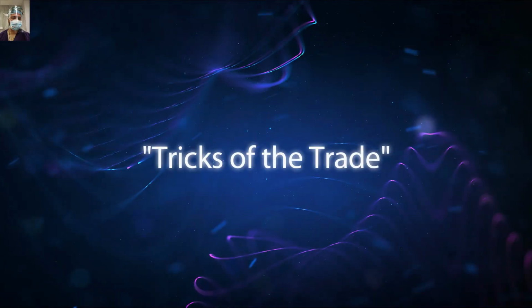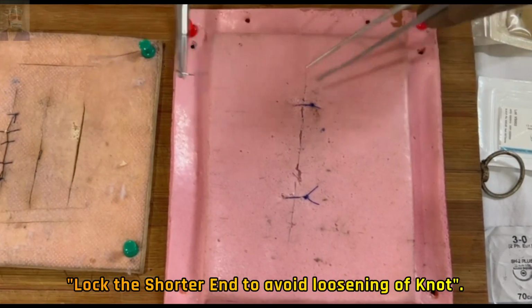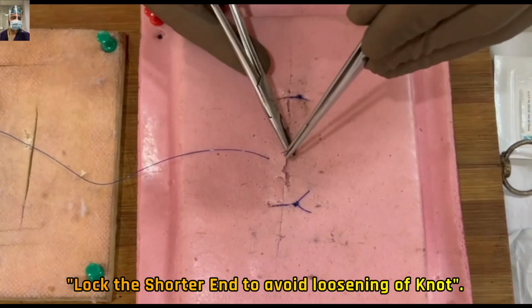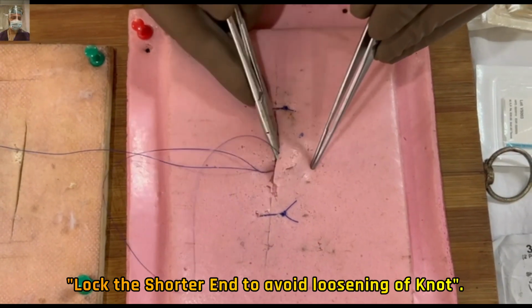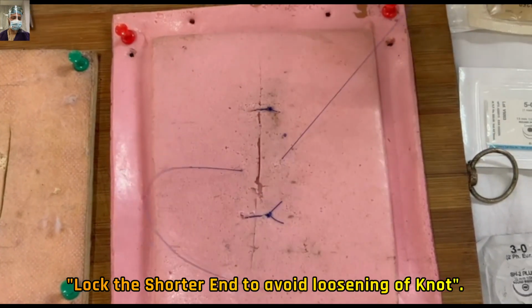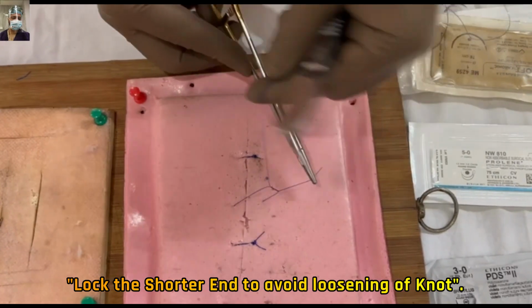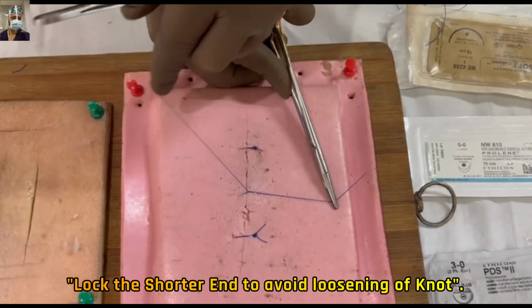The trick of the trade for you guys will be this: sometimes the tissues are under tension, and while you are applying the knot it will automatically get loosened. So how do we avoid that? How do we lock the knot? I came inside the V, took 2 throws, and if it's not holding, here we are using Prolene, you can see how easily it is slipping, and the margin will slip. So how to handle this: keep the longer end under tension and rotate the smaller end to one side, and it will automatically get locked.